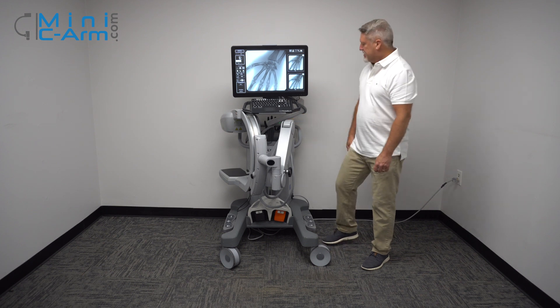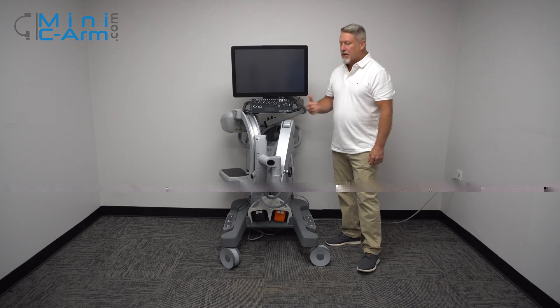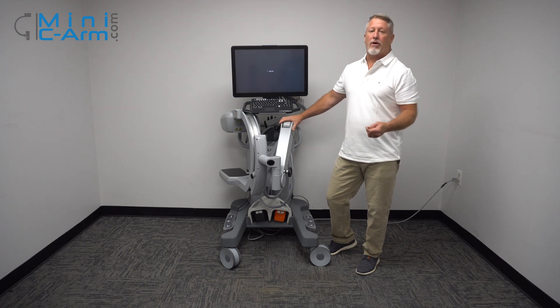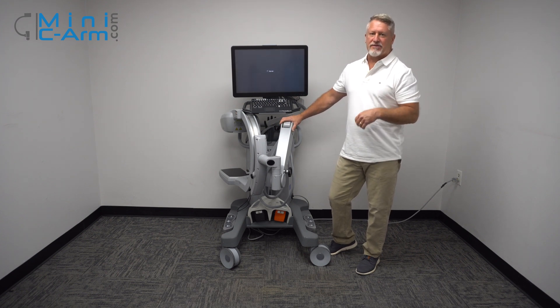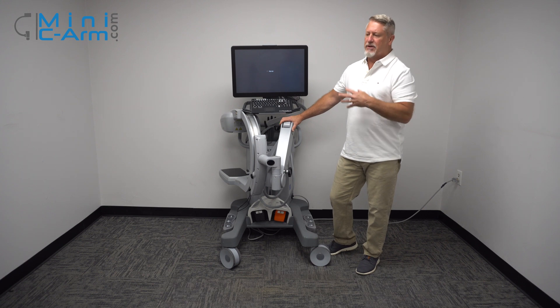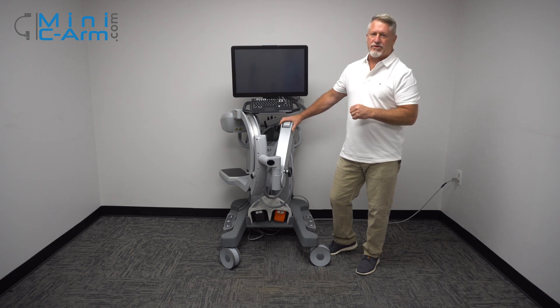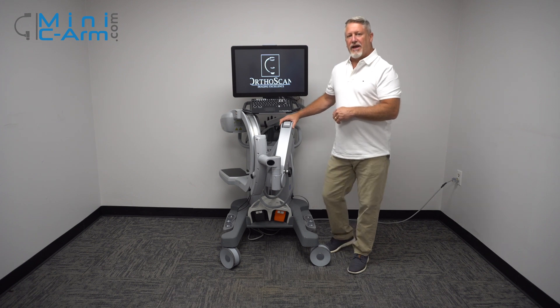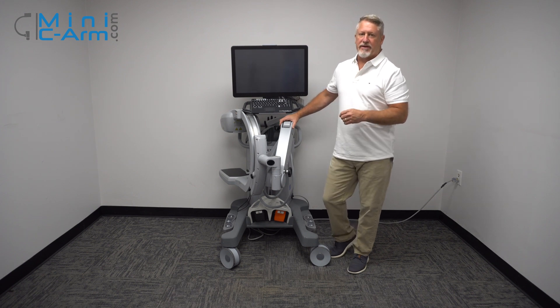When you finish using the machine, just simply press the green button, wait for the fans to shut off, and then unplug it. The reason you want to unplug it is just in case there are any electrical disturbances — when the machine's off, it won't damage it. Also, the reason you let the fans shut down is it lets Windows shut down properly.